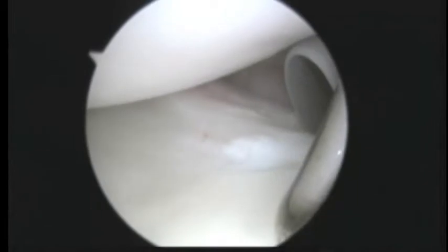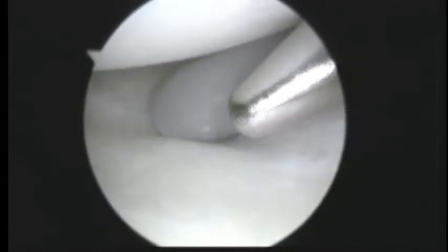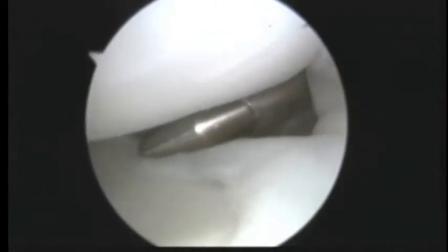And then as we look down anteriorly, we're going to tighten up this ligament down here below as well. So we're going to put the camera in the front, have a look from the front to the back.